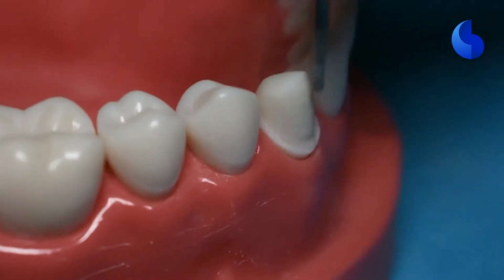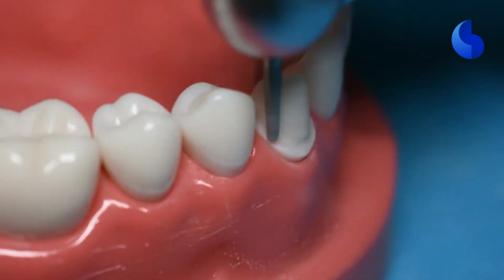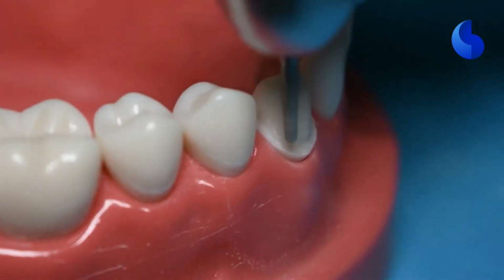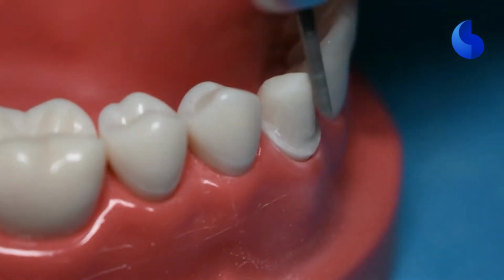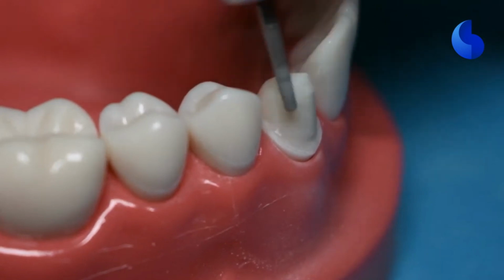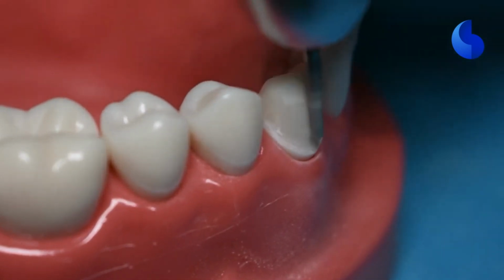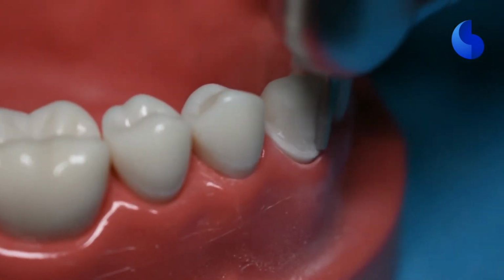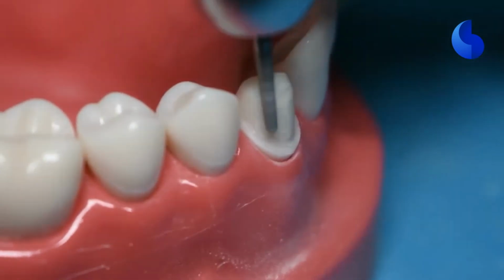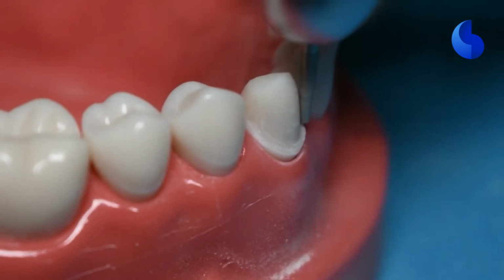Now is the time we switch to our slow speed and back to our 856-016 burr and start refining our margins and smoothing out all the small scratches that we would have made during our tooth preparation. Run this burr all across from the facial to the proximal to the lingual surfaces, while also rounding off our incisal edges to give us a smooth flowing prep that just looks beautiful to look at.